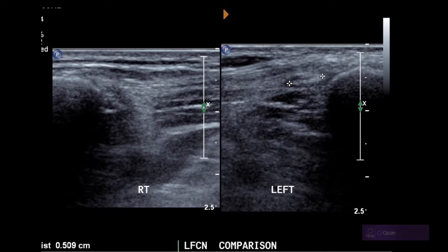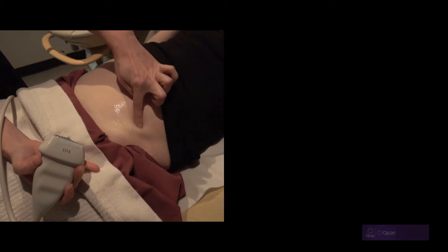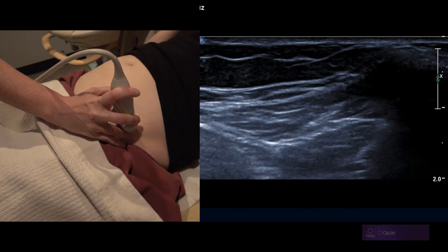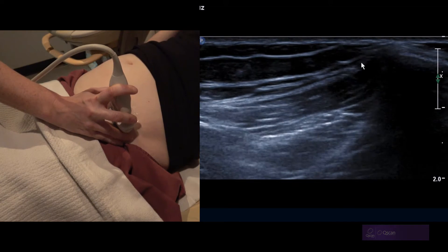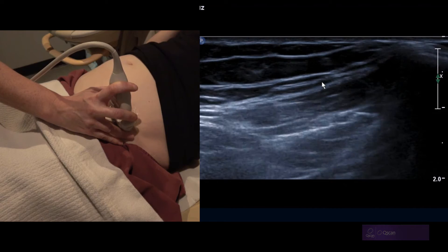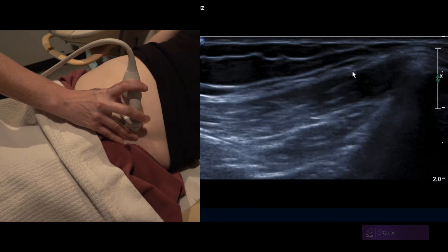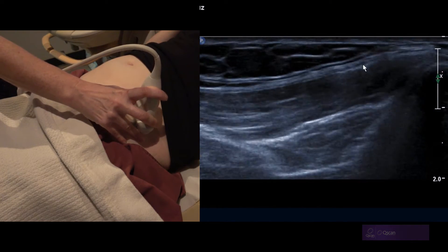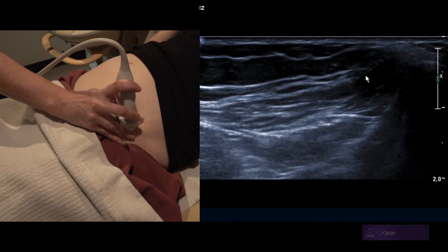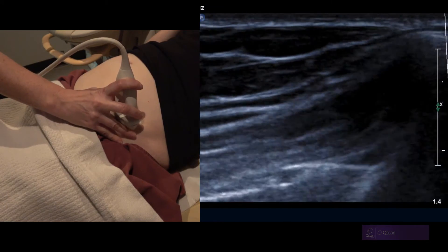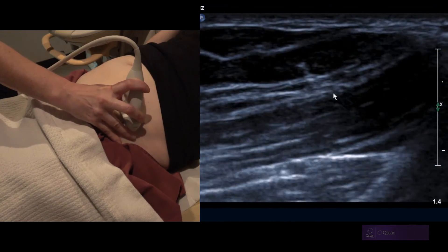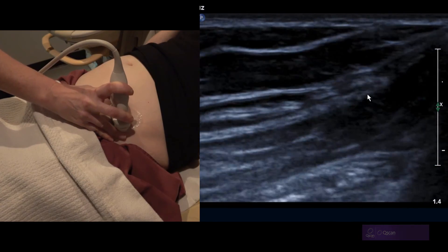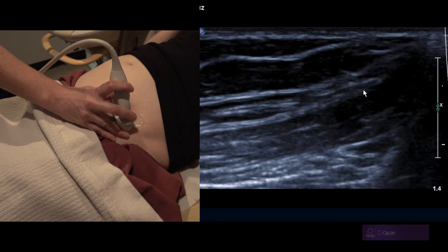Just running through the technique again: you place the transducer in transverse on the ASIS and maintain good contact medially so that we can find the inguinal ligament. Then we start looking just beneath or through the ligament. As the probe is moved up and down, look for the little bunch of grapes sign — it's a very tiny nerve normally. As you lock onto that nerve, zoom up. We're using a 17-5 transducer. Move the probe distally and keep your eyes on that nerve for any diameter or cross-sectional changes. Then compare with the other side. We could even use an ellipse tool around the nerve to demonstrate thickening.